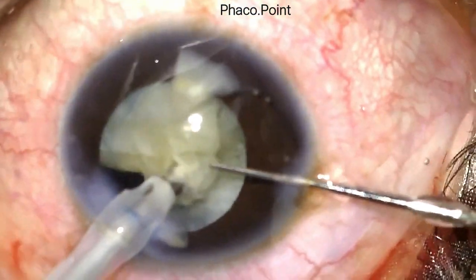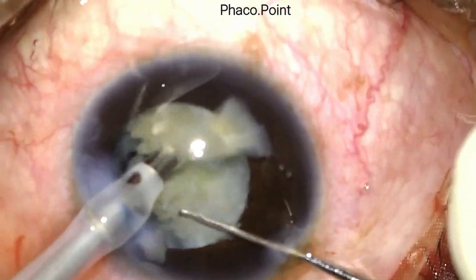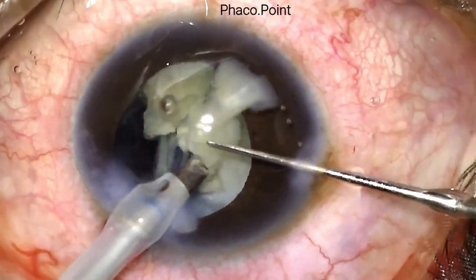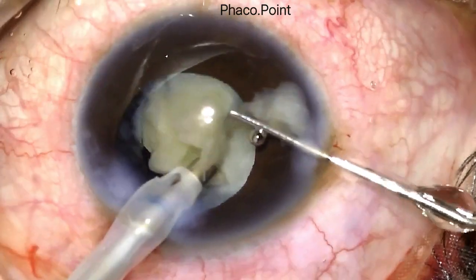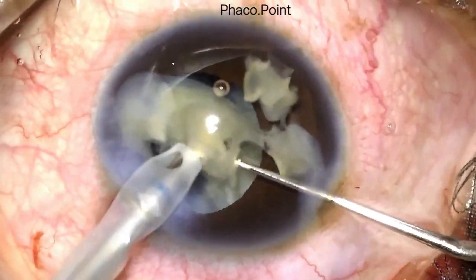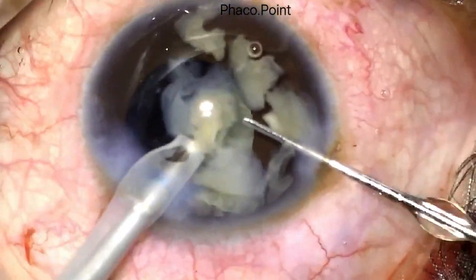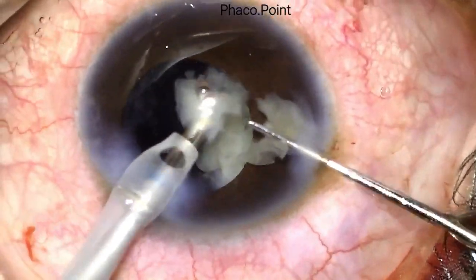It is also important to work with low flow settings: a power of approximately 30%, a flow rate of 26–28 cc per minute, and a vacuum of 200 mmHg. This is extremely important because in a case like this with a compromise in the anterior capsule, you want things to happen in a slow, controlled fashion.